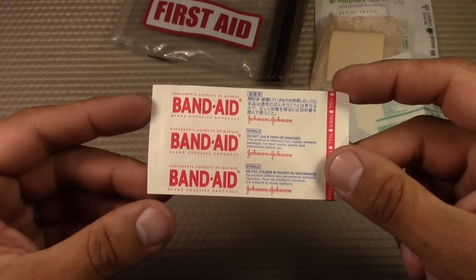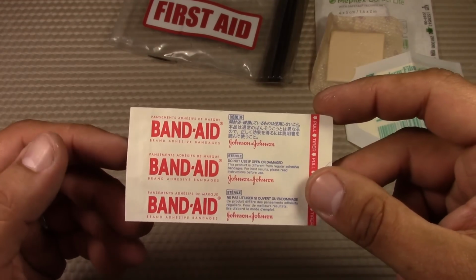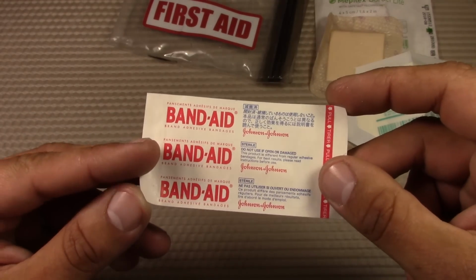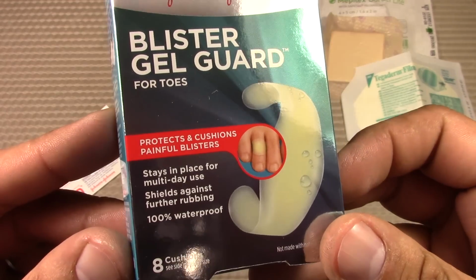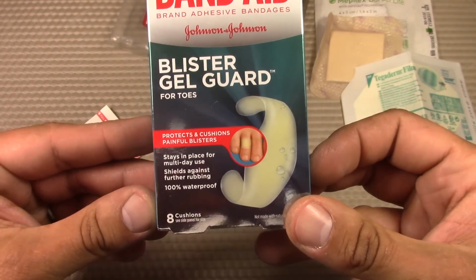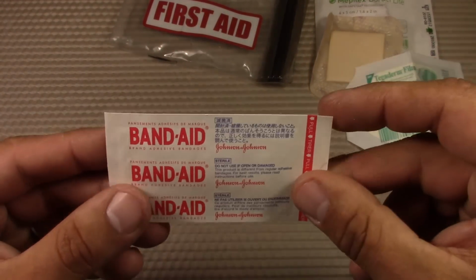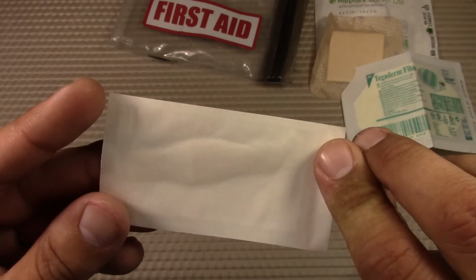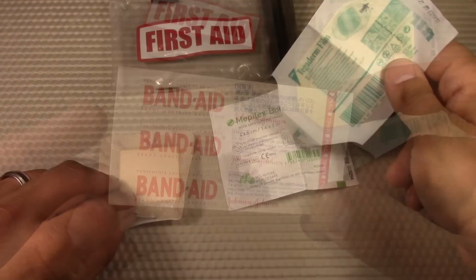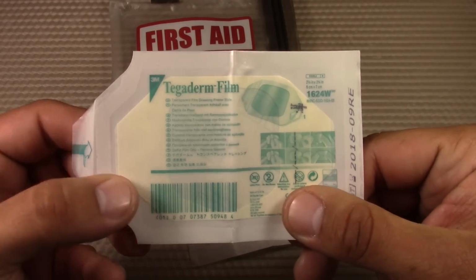I also include more of a specialized Band-Aid. This one's designed for advanced healing for blisters on the fingers and toes. It's kind of a multi-purpose bandage. It's waterproof. It has a better adhesive to it. It has cushioning in the gel pad to help relieve pain for protecting from blisters. So instead of having blister pads, I've been using these Band-Aids that are waterproof, and they could also be used for multiple things.